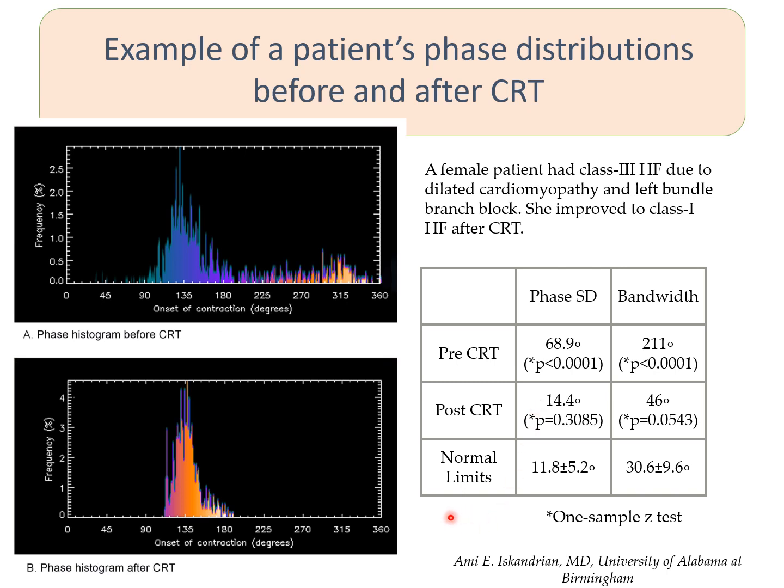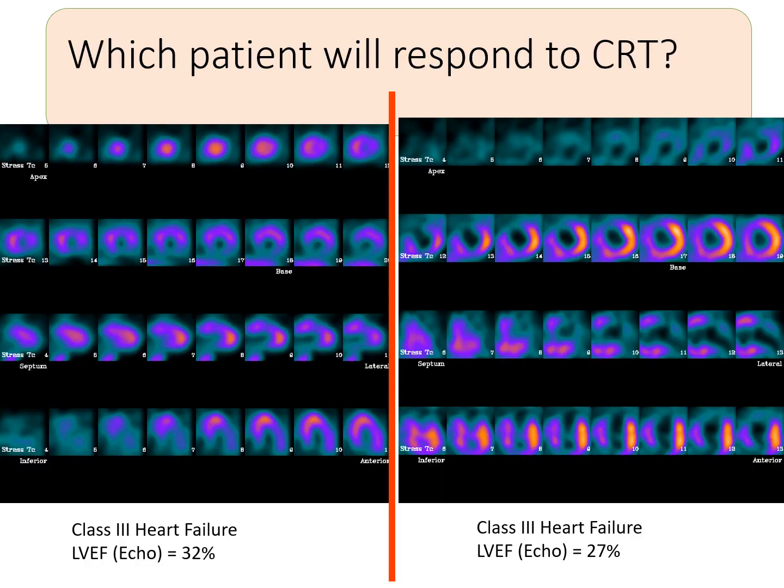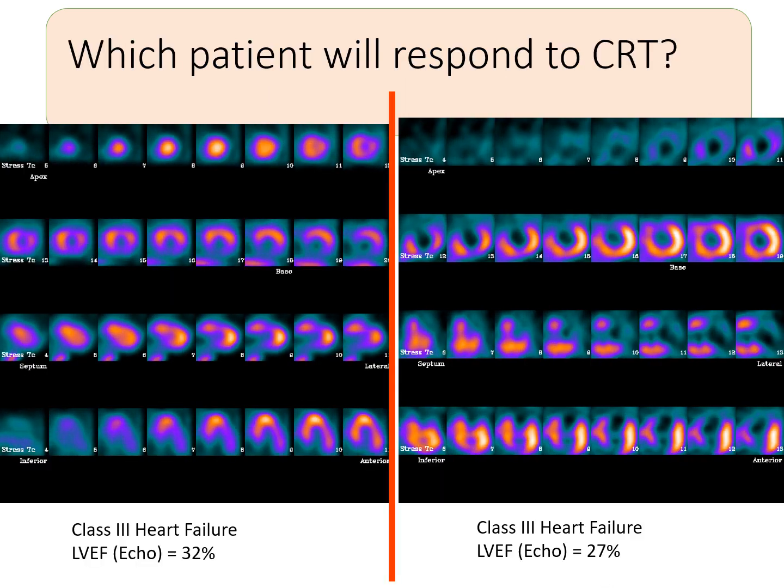And thus, just by looking at the histogram, you can see when CRT has benefited the patient.